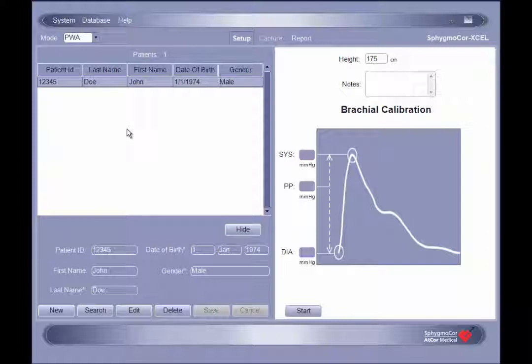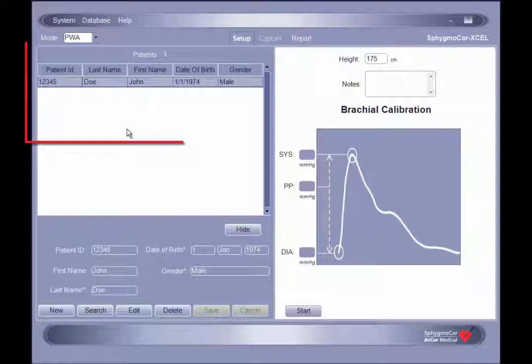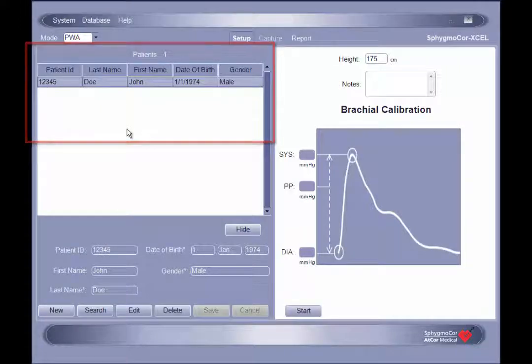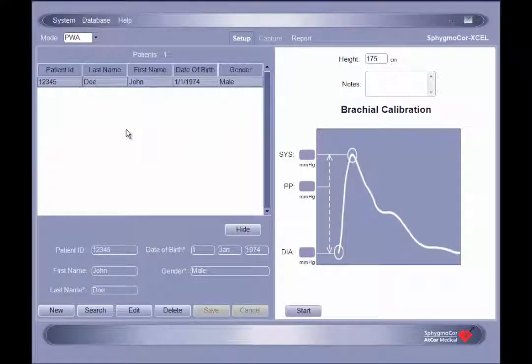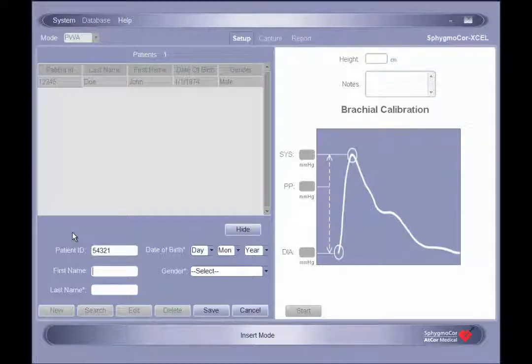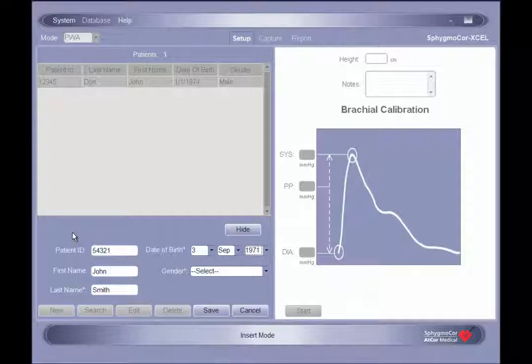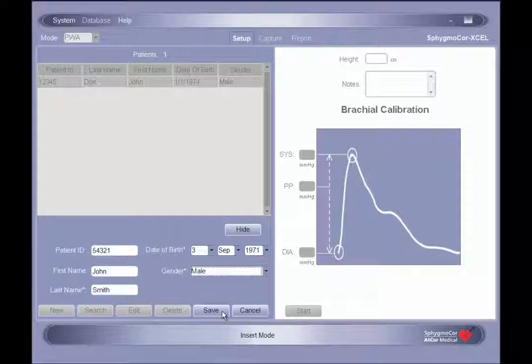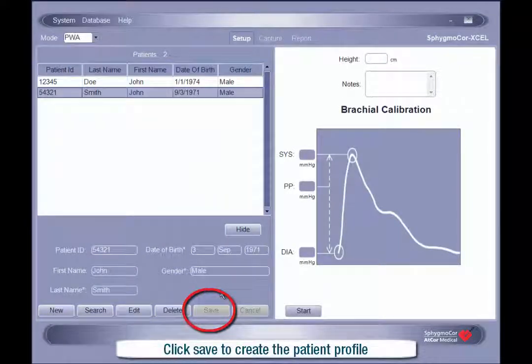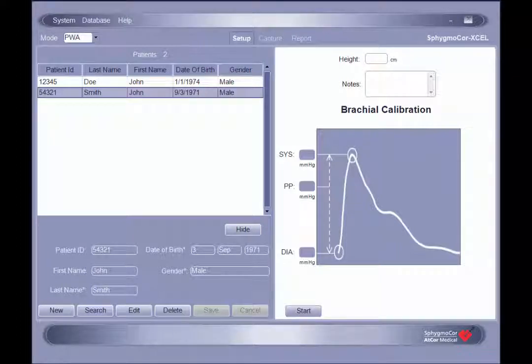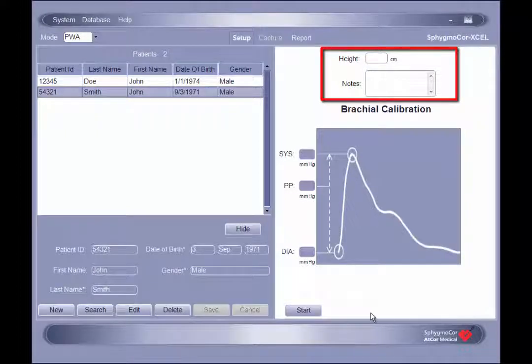If the patient has already had a profile created in the SphigmaCore XL software, locate that profile in the patient list and then proceed with the assessment initiation. To create a new patient profile, click New in the lower left-hand corner of the setup screen and enter the patient information into the appropriate fields. Required fields are noted with an asterisk. As few as a single character can be entered into any field with a maximum of 10 characters for the patient ID and 25 characters for the last and first name fields. On the right-hand side of the setup screen, there is an option to enter the patient's height. There is also a notes field that allows for free text entry.